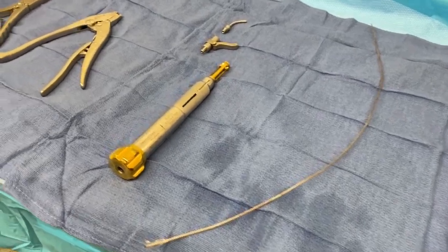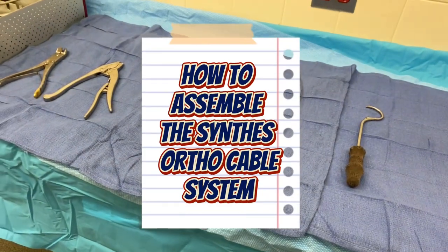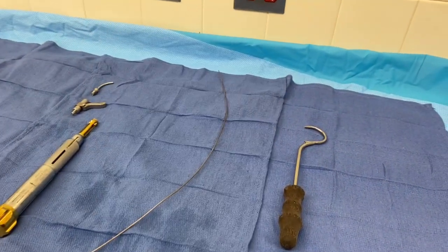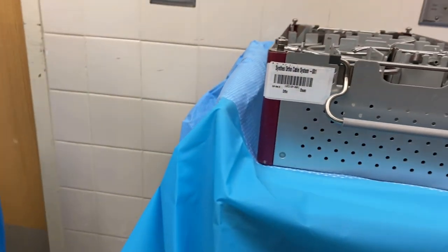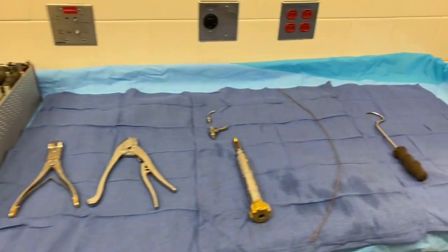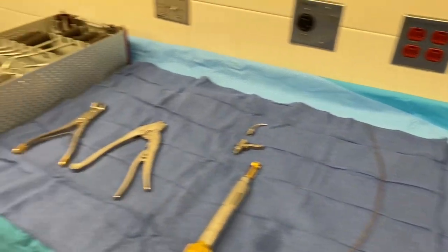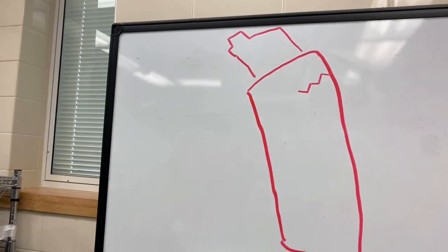We just did a total hip procedure and we had a crack in the femur. I wanted to take this opportunity while the tray was open — this is Cynthia's ortho cable tray — to show you guys the instruments that we use in order to fix a fracture. This is just a little illustration we have here.